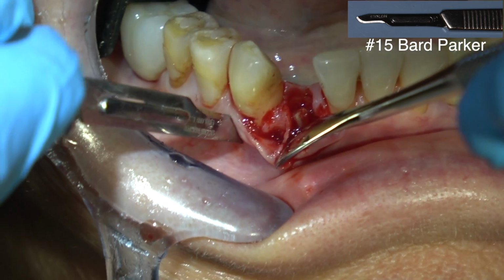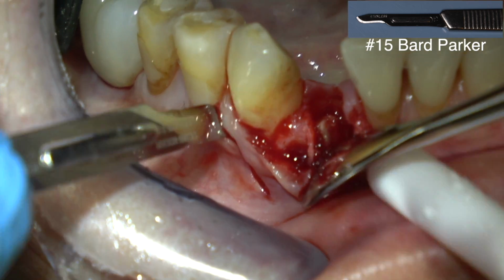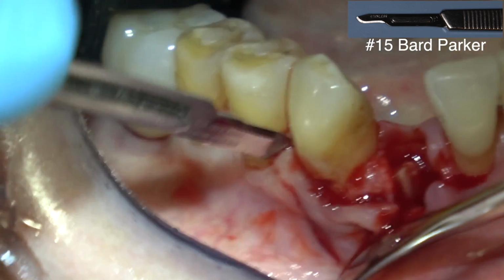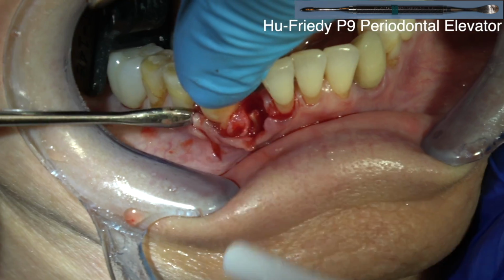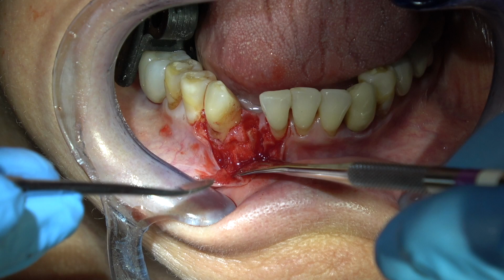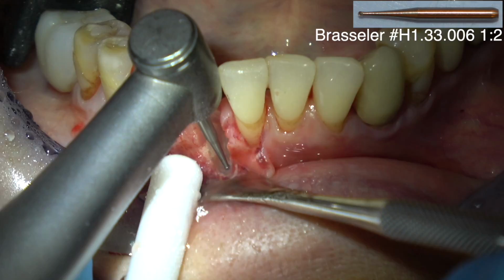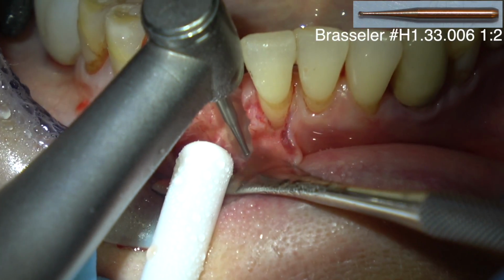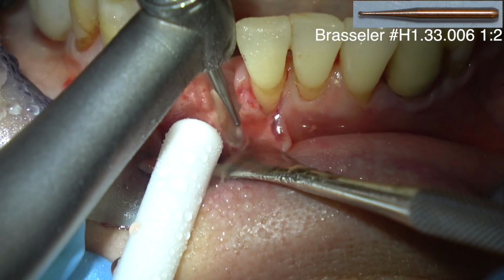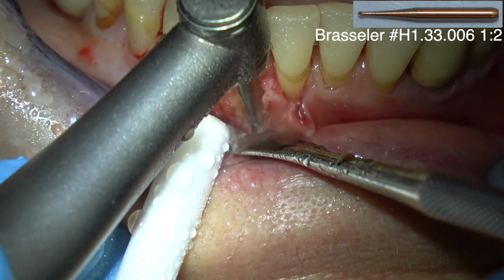Now when I'm doing this releasing incision, I want to reflect the facial 1/2 of the papilla, but I want to leave the bulk of the papilla in place so I can suture the flap precisely back to the papilla. Again, I'm trying to elevate that part of the root. I'm going to go down and remove some more of the apical part of the mesial of that root with this small long shank round burr.